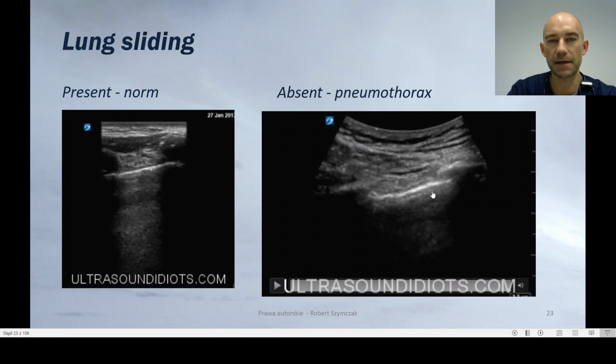And in the trauma patient, we should think about pneumothorax. And if together with this sign we've got some silence on this side, and the trauma is on this side, we should consider pneumothorax. And if the patient is in shock and has a lower conscious level and respiratory problems, that's, let's say, the time you have to decide to perform a tube thoracostomy.